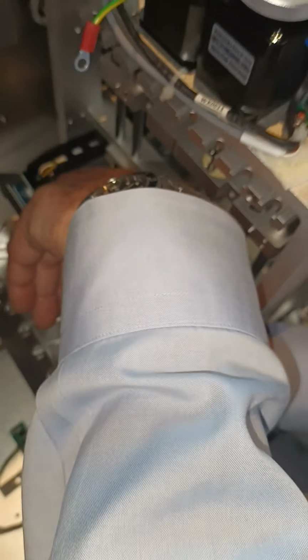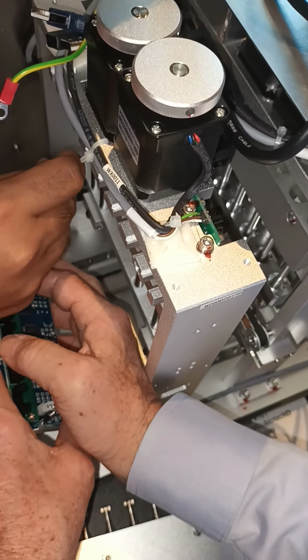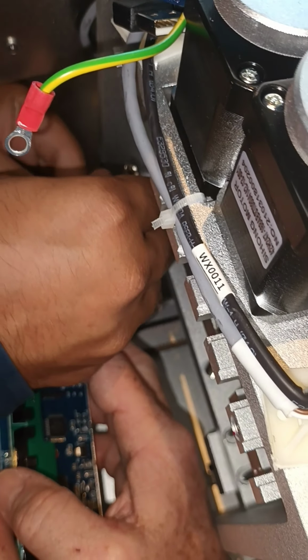Can you use the tiny screwdriver and loosen them out? Make sure you know how they go in. Brown is the P plus. White is the P minus.